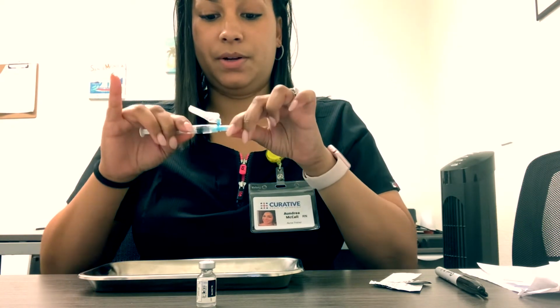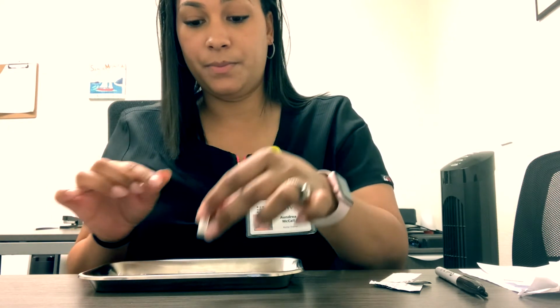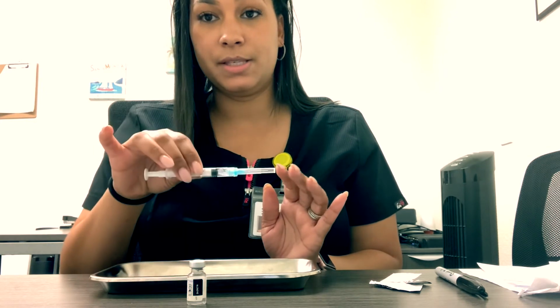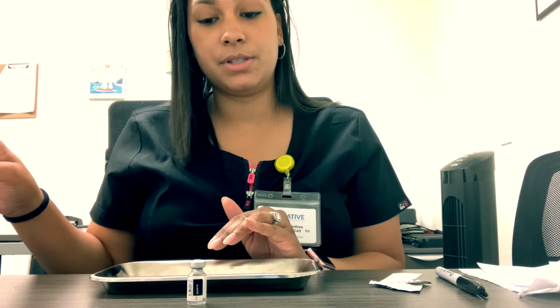Then you're going to hear the click and then give it a little twist. You've punctured this vial, so now you need to put the time and date on this vial. You have to pull up all 5 of your doses within 30 minutes. If you have pulled all 5 of them up within 30 minutes, you can now return these prep syringes to the refrigerator and they are good to use for 6 hours. You do not have to subtract the 30-minute prep time.